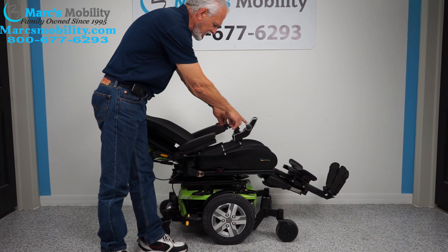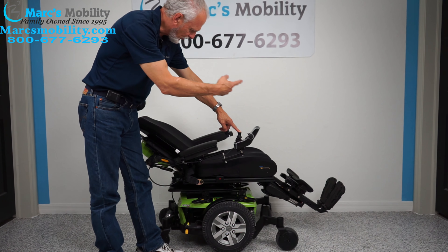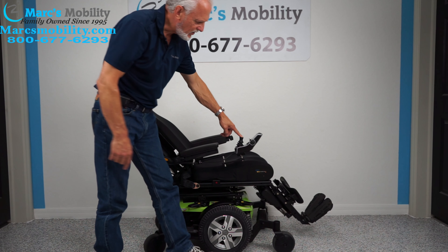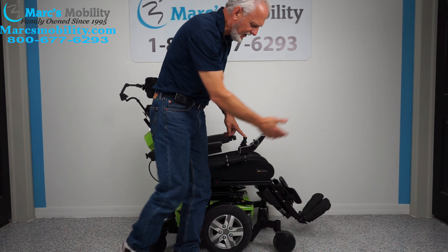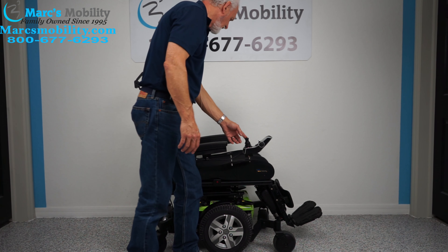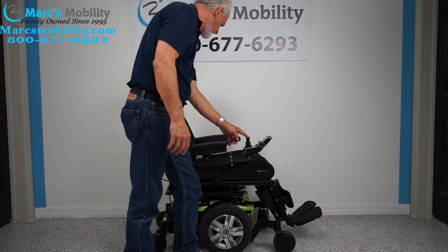I put the back yellow and the legs yellow and I can bring everything back to a sitting position. When you're outside, leave your legs out a little bit so you have more room. I'm going to bring the back forward a little bit more.